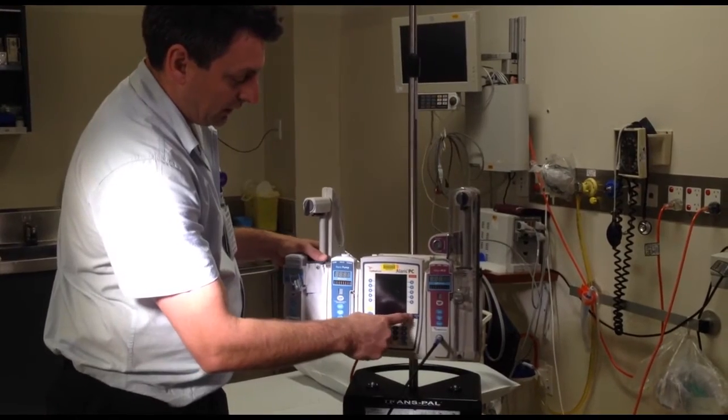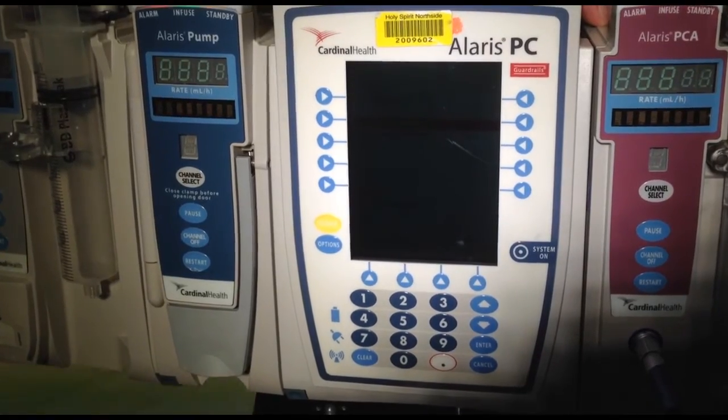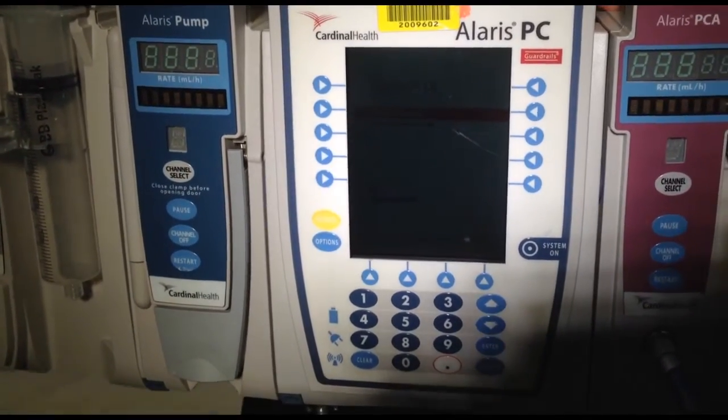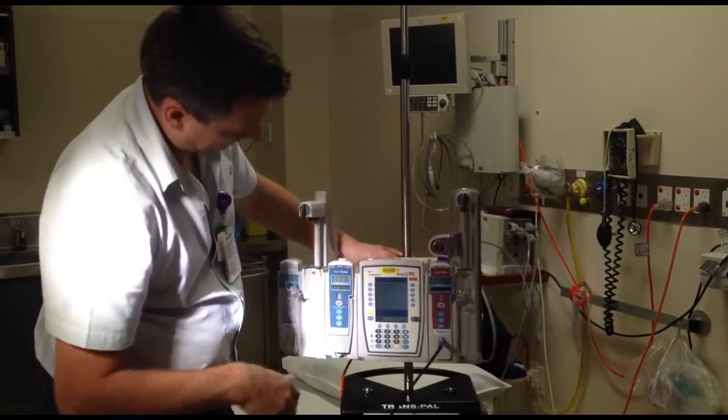The first button we want is system on, so we click on that. What will happen is it does a self test — checks all the lights are working. Make sure all the lights come on the front and then you hear a beep. That means it's done a self check and it's safe to use.